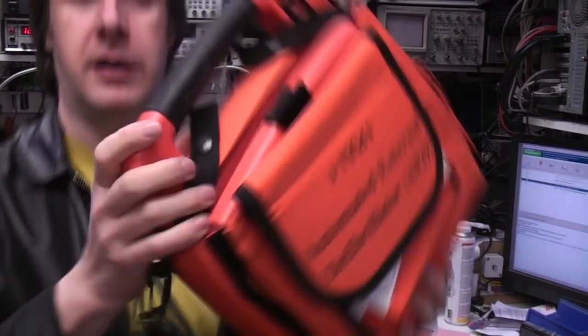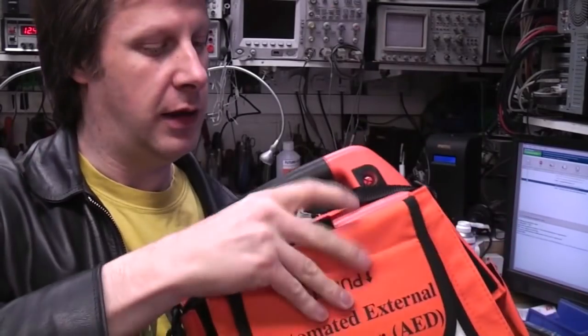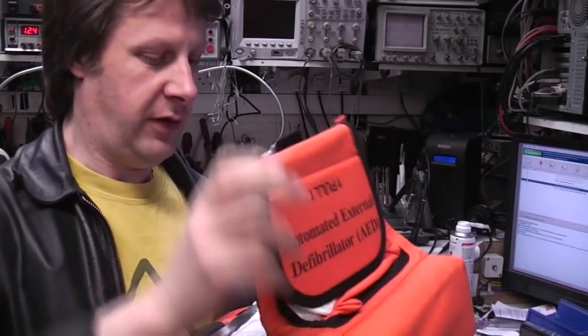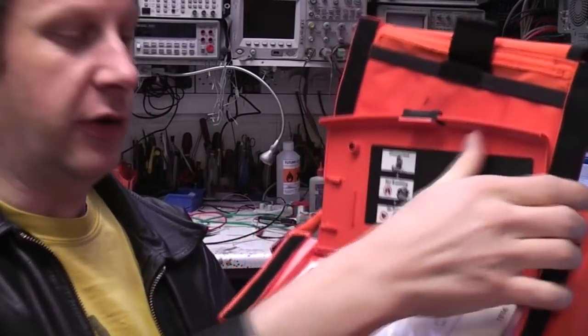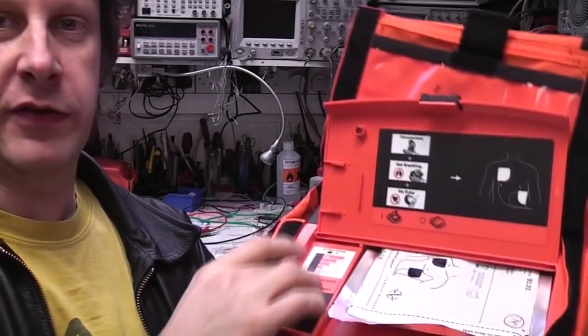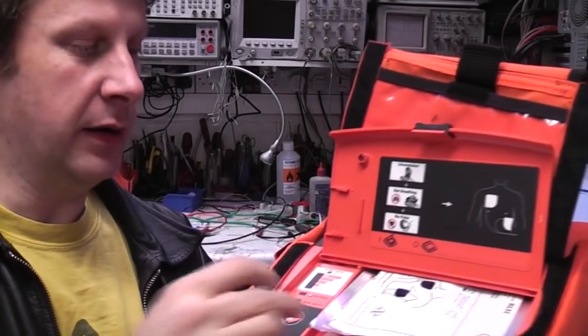It comes in a nice rugged case with a nice carrying handle. As you expect, very simple controls and you open the lid and that's what turns it on. You've got a few simple indicators telling what the battery life is and just a go button.